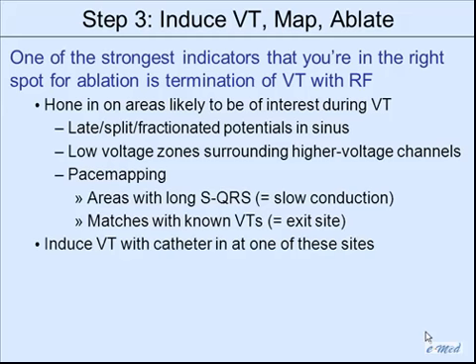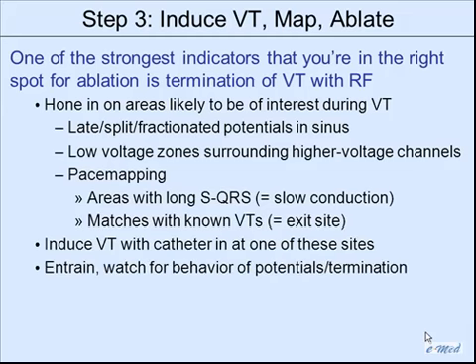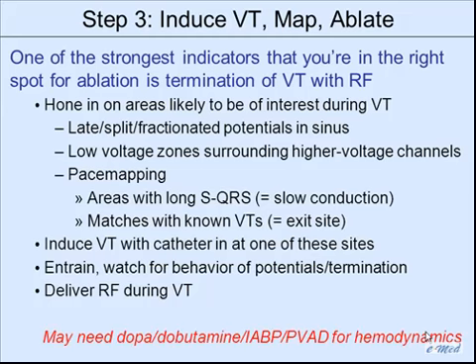And I tried to induce VT with a catheter at one of these spots, lying in wait for it there, and see if we can see the resulting electrogram. Then entraining and watching for potentials, how they behave with entrainment, whether they're bystander sites or good sites, delivering RF during VT. And I really can't remember the last case of scar-based VT that we didn't need some hemodynamic support. I haven't done any cases with percutaneous VADs. We've done, I don't know, 7 or 8 mechanical VADs. They're an interesting lot to have to deal with. Finding a pulse in people with continuous flow VADs is interesting.